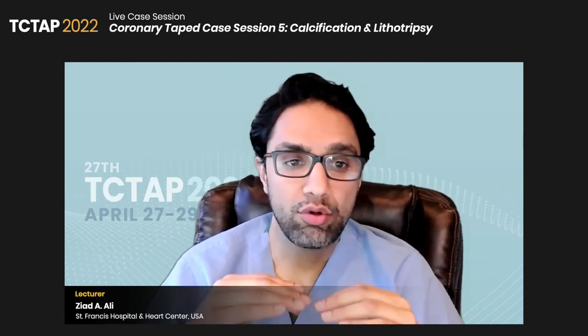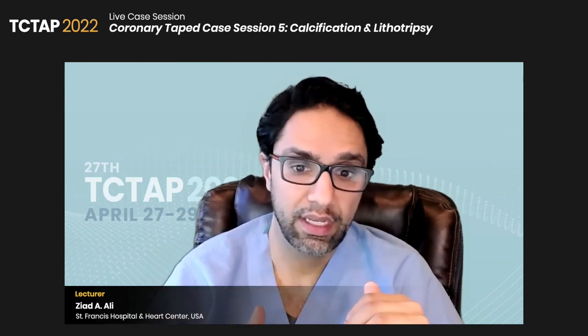The next 33% of cases are the popcorn, but it's actually sitting on a big plate of calcium. In those situations, the intravascular lithotripsy fractures the calcium underneath the popcorn and lets you push it. It allows true vascular compliance.